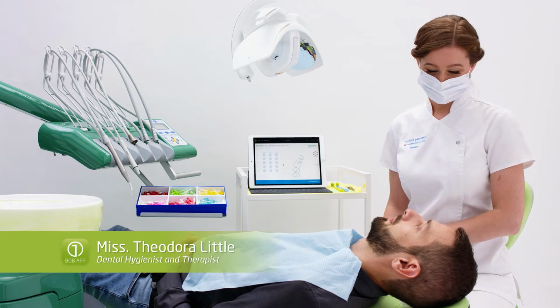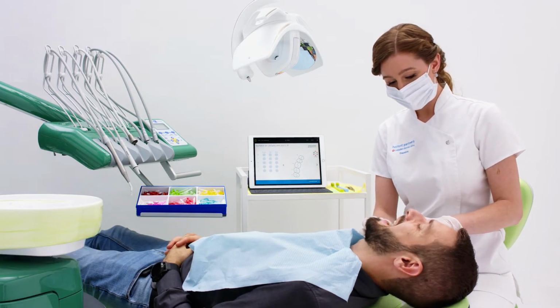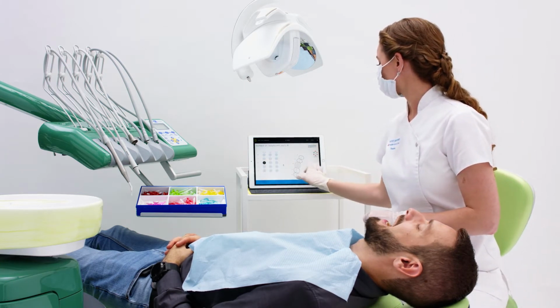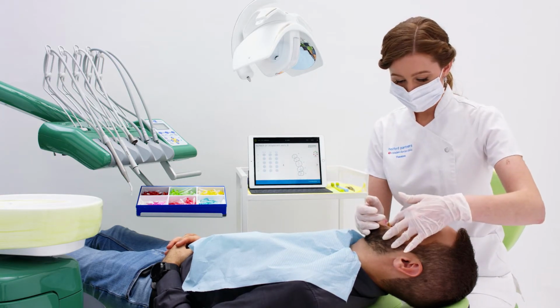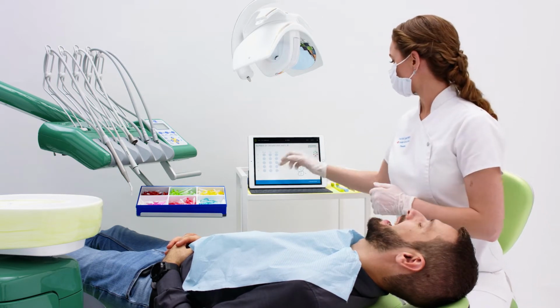Bob Silent method is without patient interaction and view. The patient can relax and Bob is for my view only at this point. As Edward is a new patient today, I begin Bob by completing an intraoral examination.